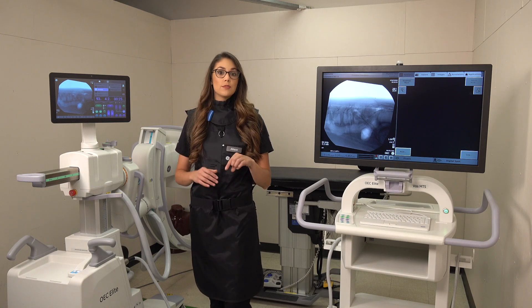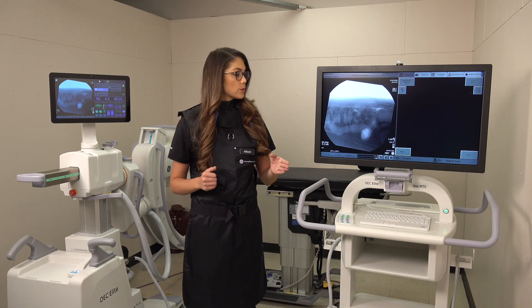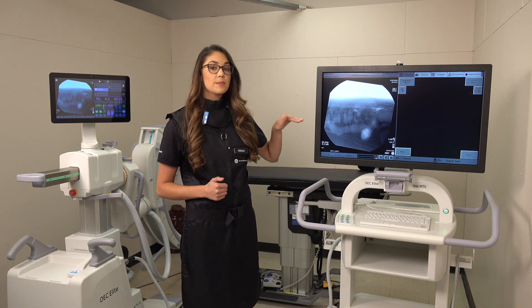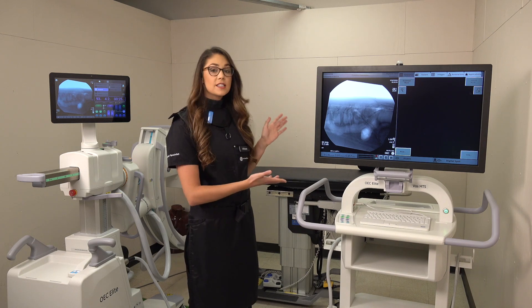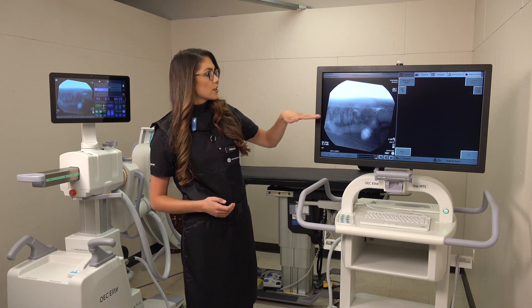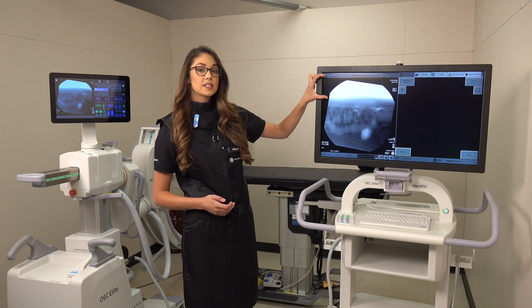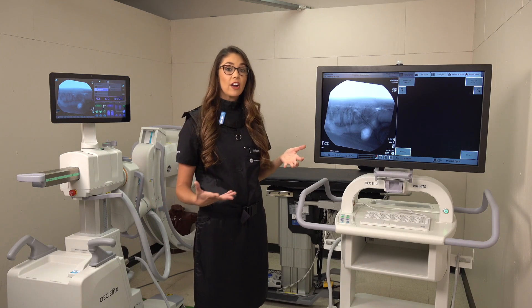The first step before you even use the collimation tools is to make sure that your image is centered. This is a lateral lumbar spine — we are centered within our field of view, and you'll see this dead space or blank air.